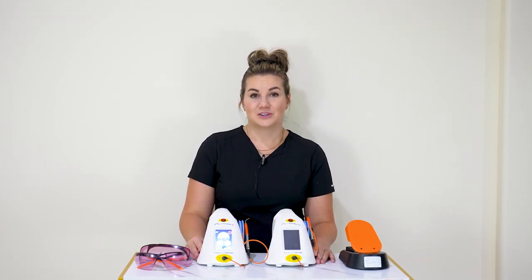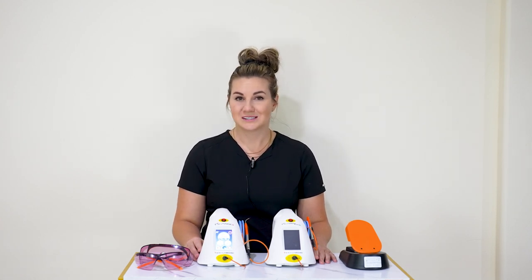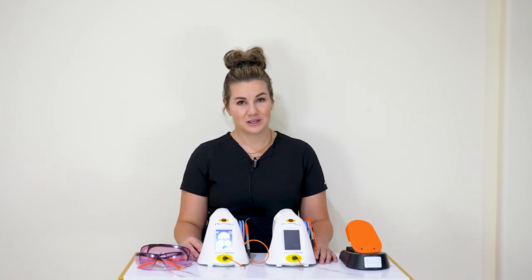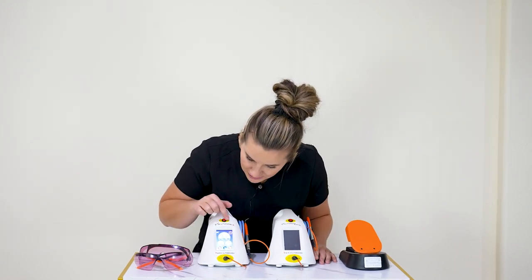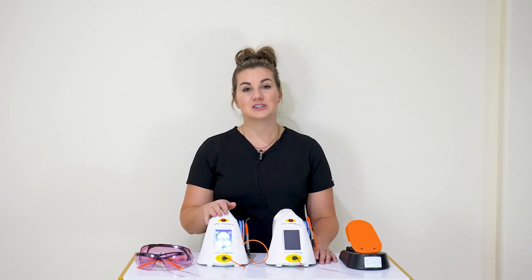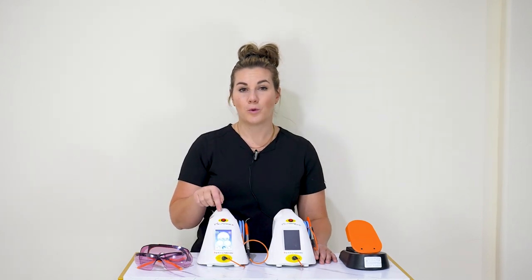The next procedure hygienists can do is laser assisted perio. You need to check your state regulations to see what your state allows you to do. Some hygienists can initiate the tip — basically making it a hot tip, able to cut tissue — and some hygienists cannot. Laser assisted perio is a post-SRP procedure. We're going to switch to the 30-second timer. If you can initiate the tip, please do so now. The best way to initiate the tip is in the green squiggly setting, because that's already set to 0.5 watts.